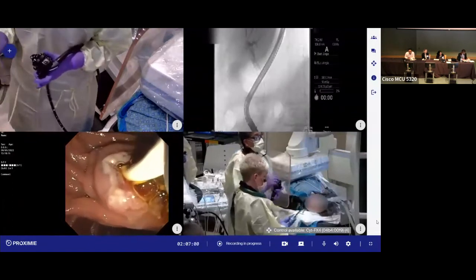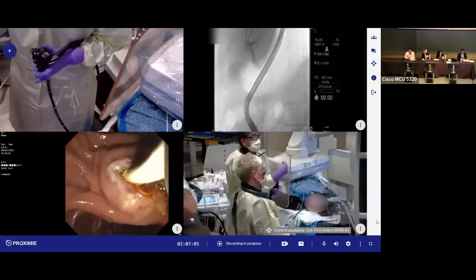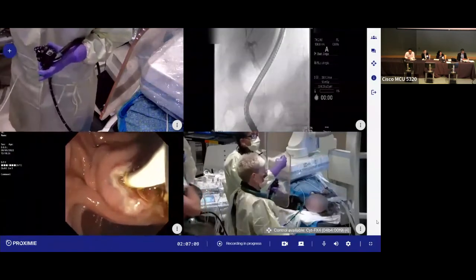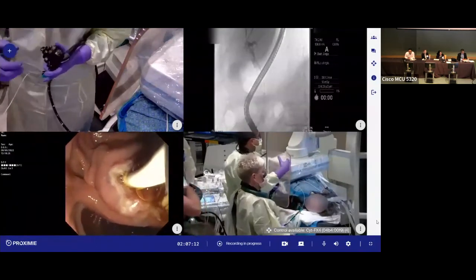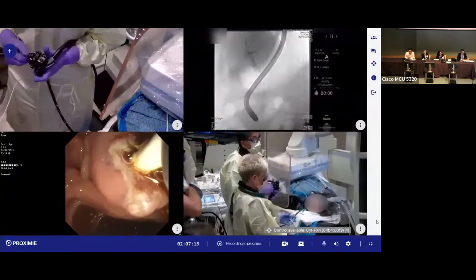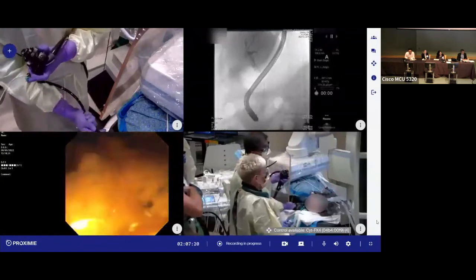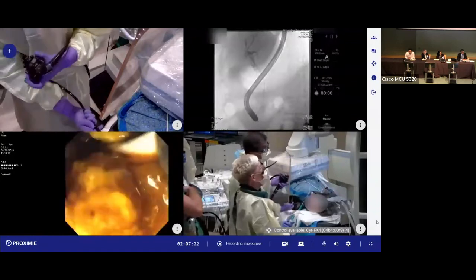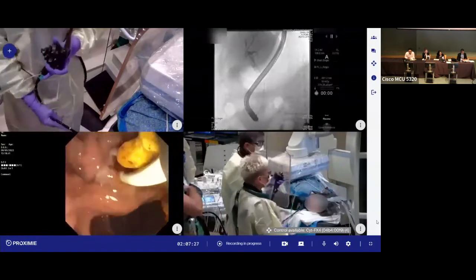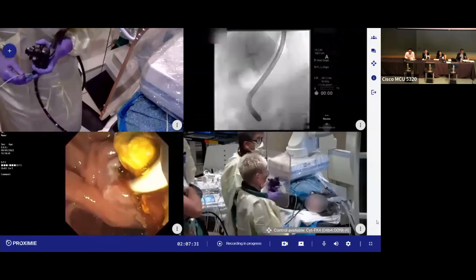But the reason I went to 12 initially is to try to get the bile duct sort of away from, or to sort of encompass the entire lumen of the bile duct, to drag the stone down. So now we're going to go to 9 and then do the same maneuver. And we got another stone there. Okay, balloon down.